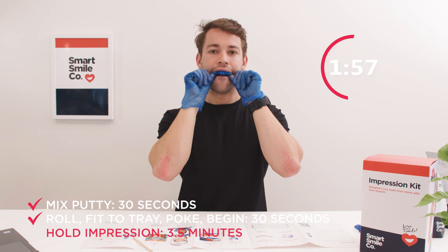Two minutes to go. Don't move your fingers around. Your impressions will be used to create a custom treatment plan. Once you send in your impressions, you'll receive a 3D interactive view of how your teeth move to their perfect position.